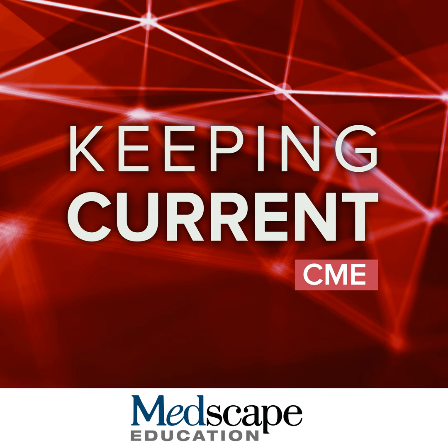And also for our patients with an atypical dementia. So let's talk about somebody with posterior cortical atrophy or a posterior occipital predominant, or some of our language predominant variations. If they have an asymmetric uptake, you may have a visually positive scan in these regions, but your overall average, since the Centiloid is standardized across these large brain regions, could be low.